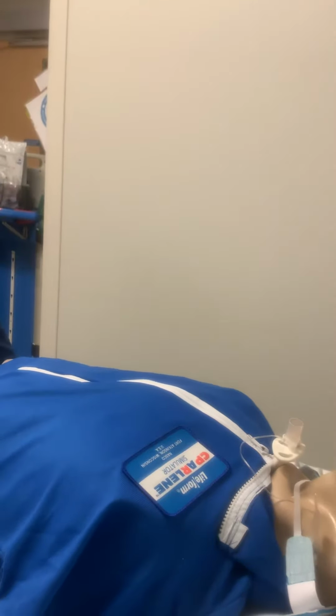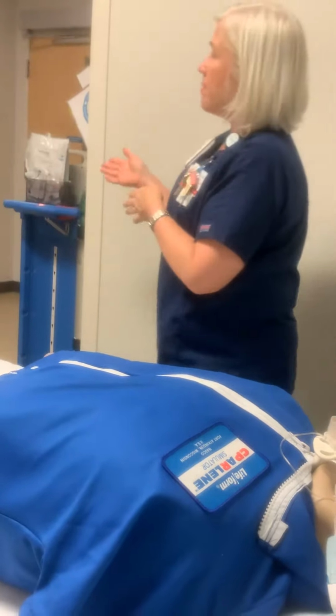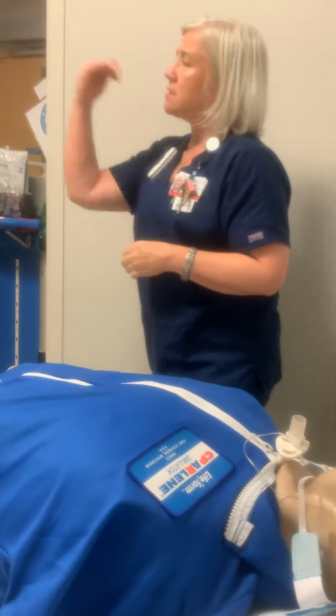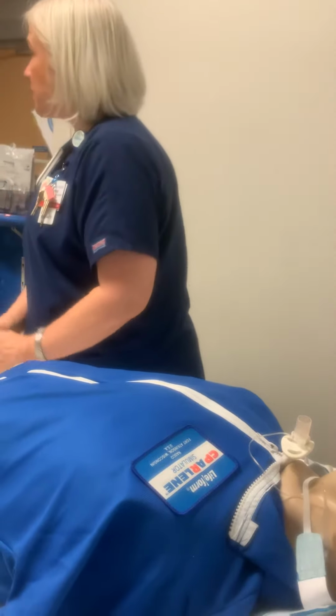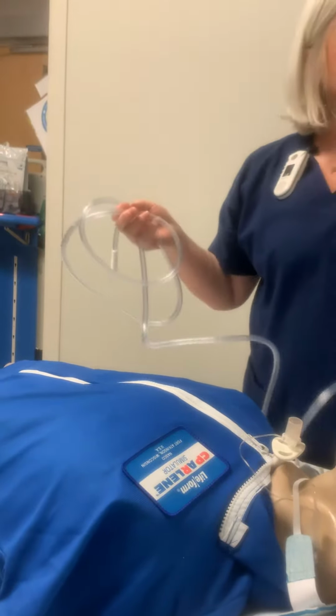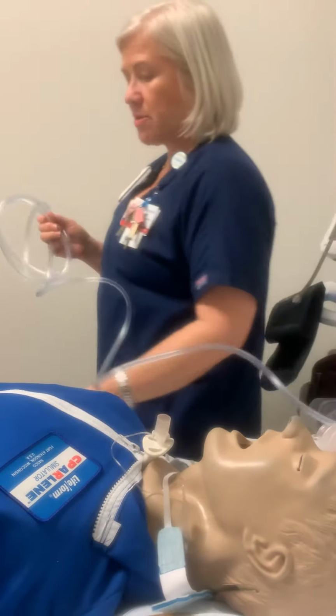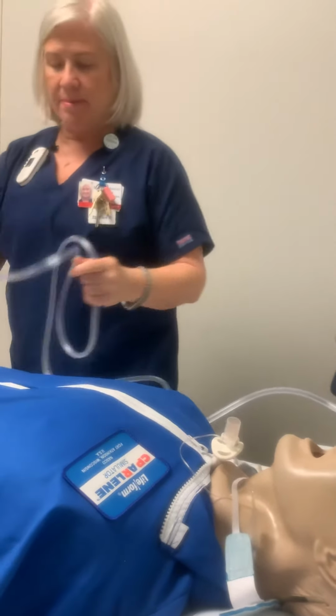Okay? So, suctioning. When you suction your patient here, we have in clinical skills is really clear about suctioning patients step by step by step, so you should just follow it sometime. Make sure you have your suction here. You don't want it to go past 150 millimeters of mercury. It's too much pressure on the lungs, okay?